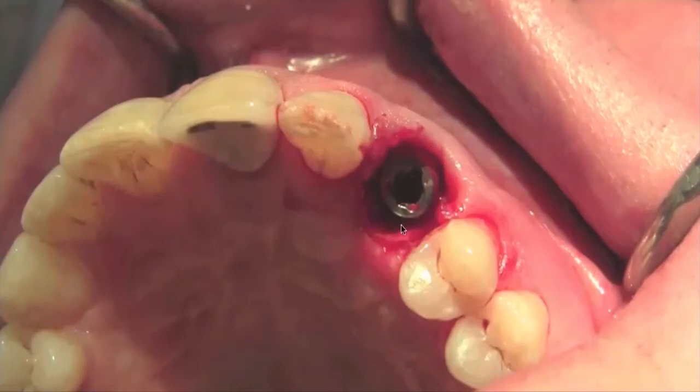These gaps are going to be filled with particulate bone. In this case, the selected graft material was Puros, distributed by Zimmer Dental, and we combined Puros with platelet-derived growth factors by OsteoHealth. It usually comes with beta tricalcium phosphate, but in this case we decided to mix it with Puros.